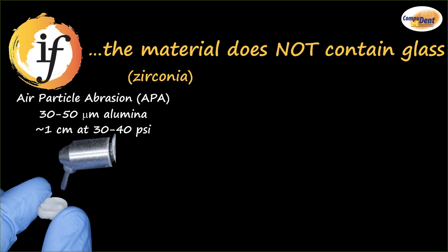Now you notice I'm not giving you exacts because really this is a cleaning step. For me to tell you to do it for 10 seconds, well, what if nothing comes out of your airline for the first 3 seconds? So it's more of a visual thing. You're just trying to clean the inside of the crown. You're not trying to cut it. You don't want to get really close or use really high pressure. Just a cleaning step so that you have a nice, rough surface to bond to.